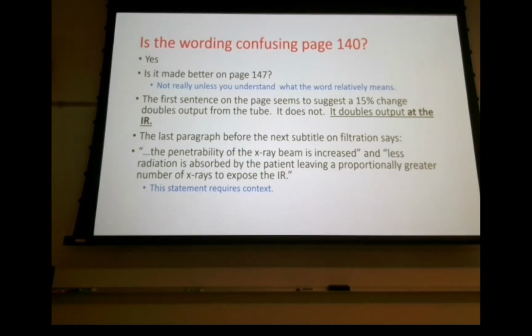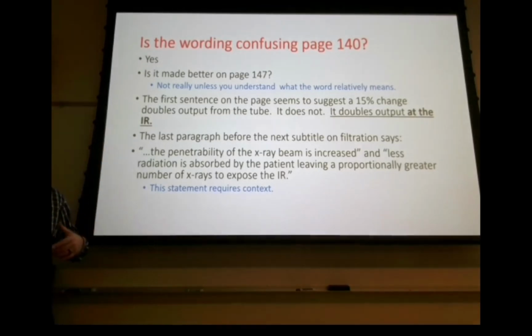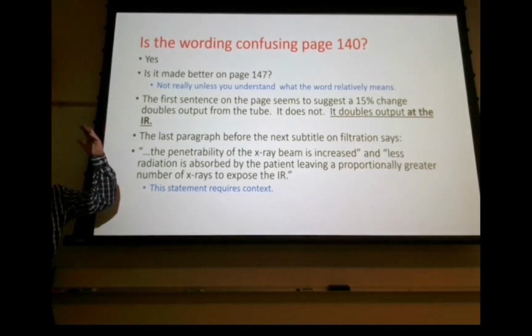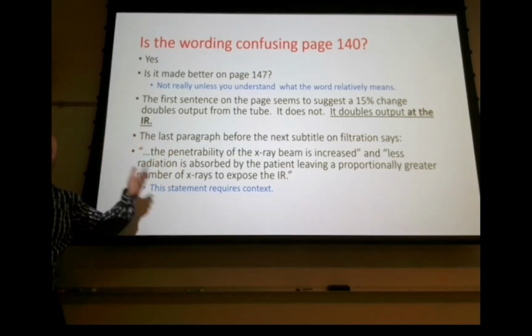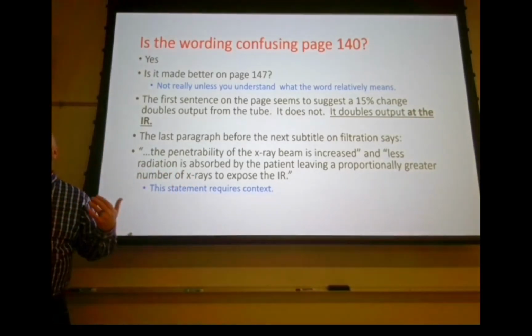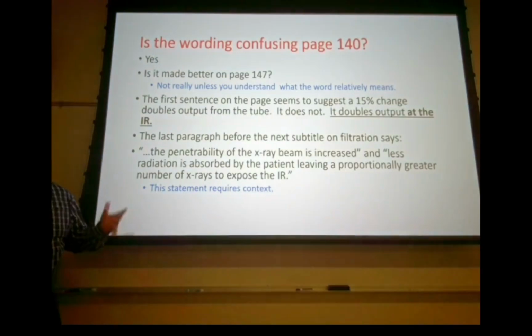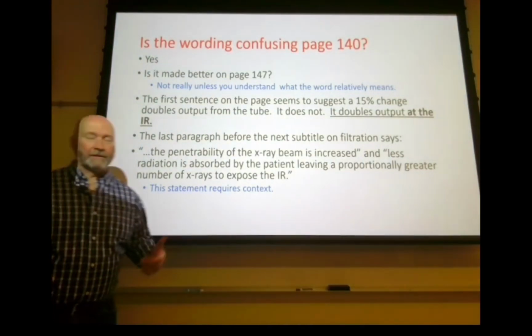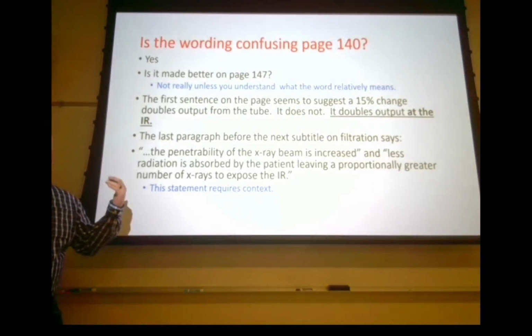Okay, so let's run through a couple of different exercises. We increase kVp, and that's the only thing that we do. And what happens? The spectrum goes up. We increase low energy, we increase moderate energy, and we increase those that are most likely to penetrate. Right? So what happens to patient dose if kVp is the only thing that we change? Yeah, dose is going to go up dramatically. Okay? So since I already started into it, is there a way that we could change our kVp and reduce patient dose?